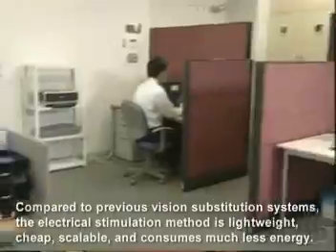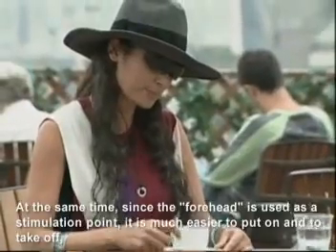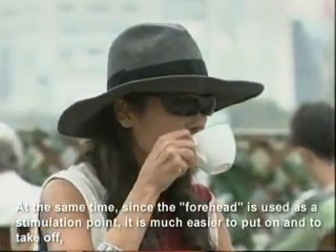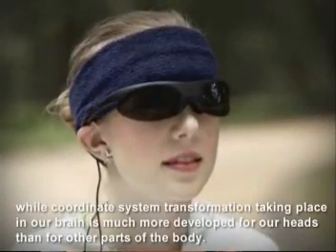Compared to previous vision substitution systems, the electrical stimulation method is lightweight, cheap, scalable, and consumes much less energy. At the same time, since the forehead is used as a stimulation point, it is much easier to put on and to take off, while the coordinate system transformation taking place in our brain is much more developed for our heads than for other parts of the body.